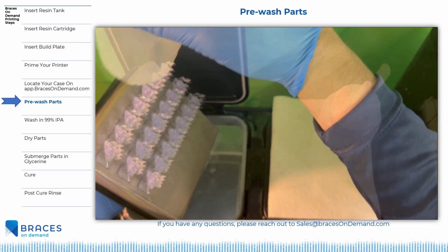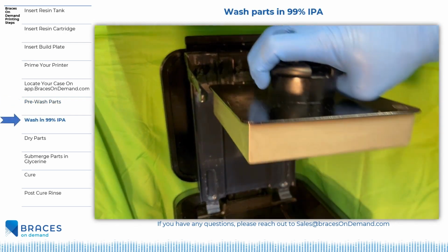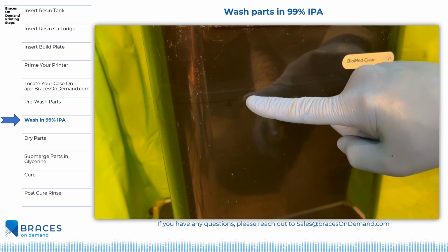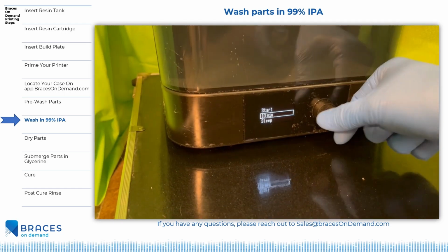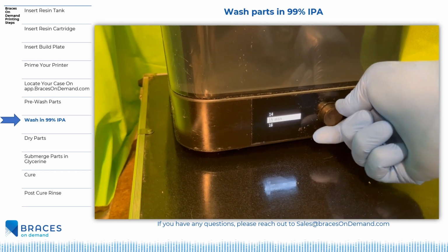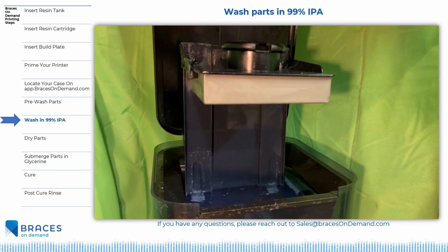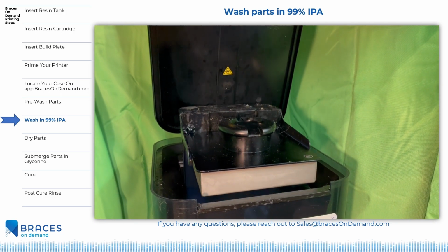Next, set your build plate on the Form Wash platform with parts hanging down. Check the level of your IPA in your wash bucket. Wash your print according to Braces on Demand's recommended time. For this print, 15 minutes is recommended for Biomed Clear.